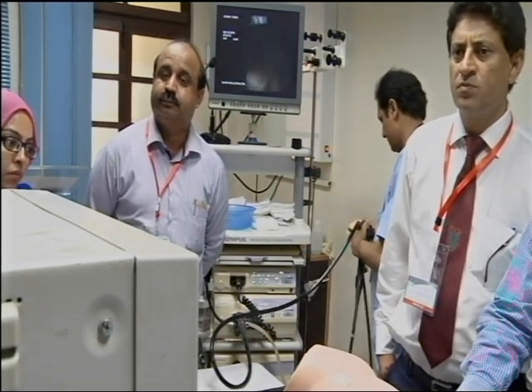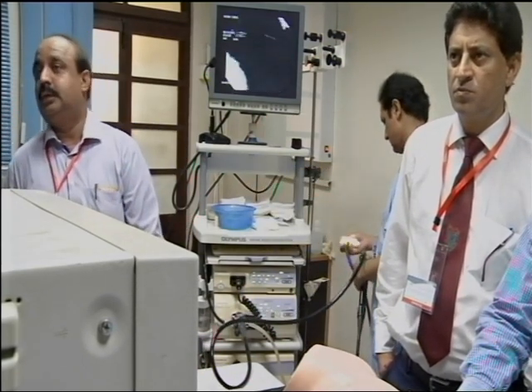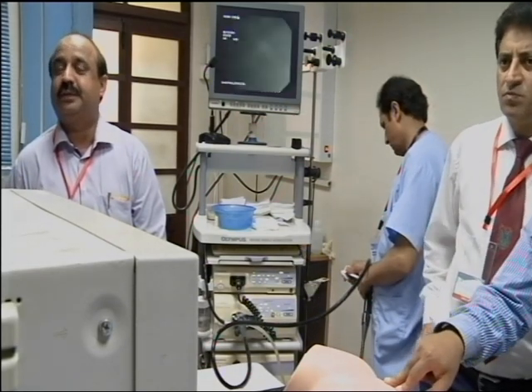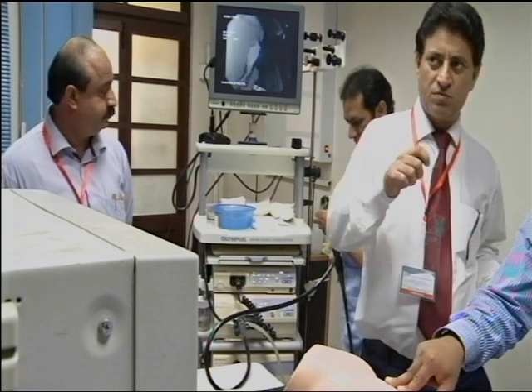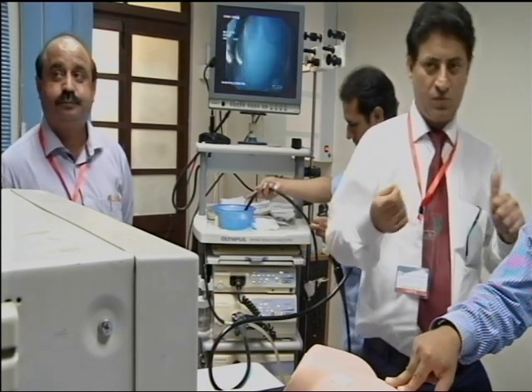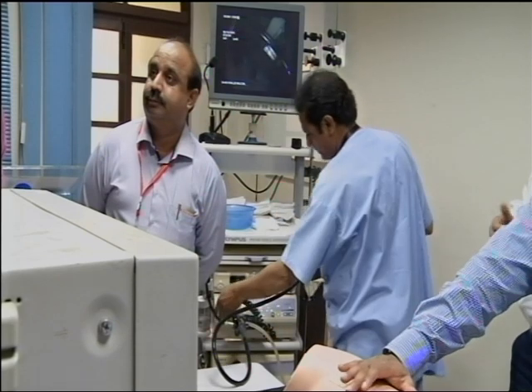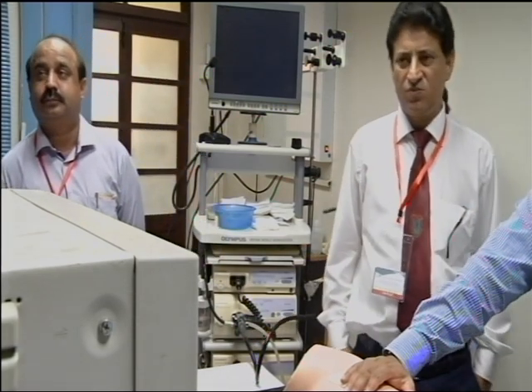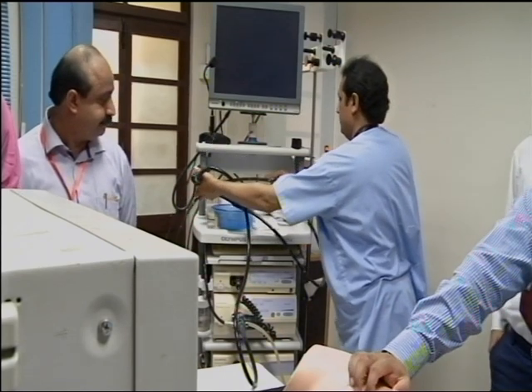I must have shown you already. You don't need to hold the scope like this. If you're going to do single, you can literally hold the scope like this. Now that's only possible if you use the other hand as well. If you want to do this clockwise and anti-clock without using this hand, it will be like this. You can't do it without this. Coordination. So you're going anti-clock, and this left hand is going away. You're going clock here, the right hand is coming. So they both go together. And this, to me, is the most important step in making your colonoscopy easy. Because it's all about torquing, right? And torquing is very difficult if you keep this hand steady. The moment you let this go, it will come down. So that's what we will reinforce and teach you, and then you go, hopefully, build on that.